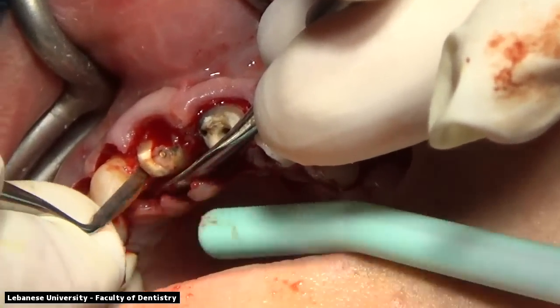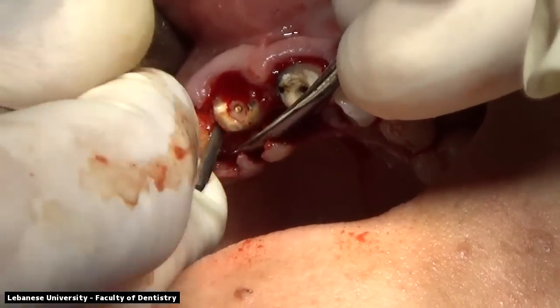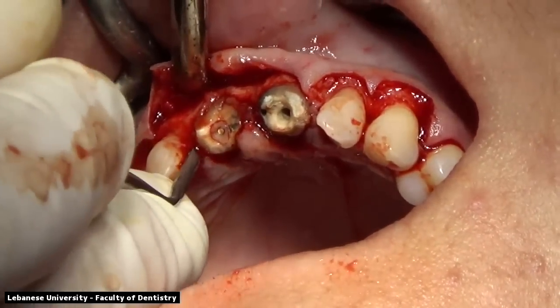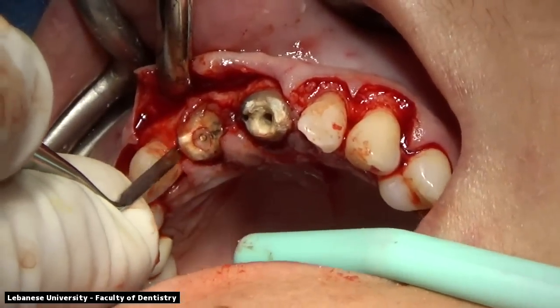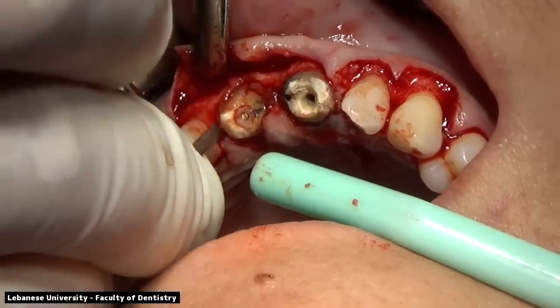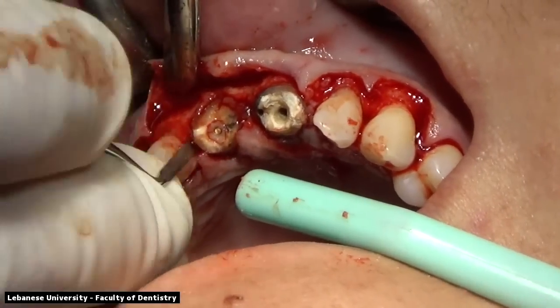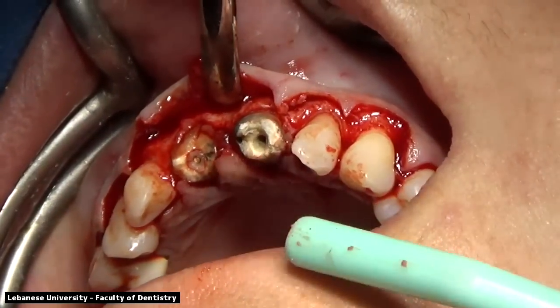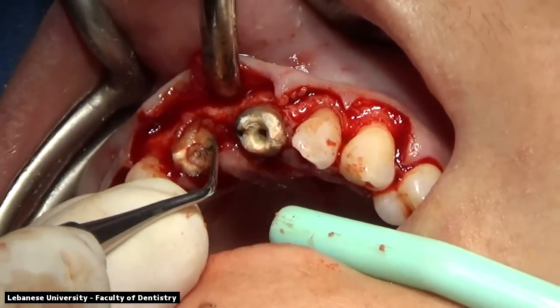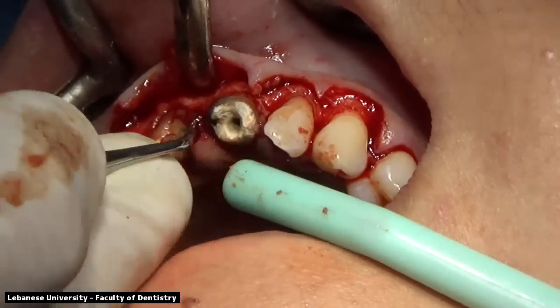A straight periotome is being used in this case. We're going in the buccolingual direction, starting at the distal side of the right central incisor. The pressure has to be inside the socket, not on the teeth themselves, and not on the buccal plate of bone or lingual plate of bone. Very gentle movements in a buccolingual direction.